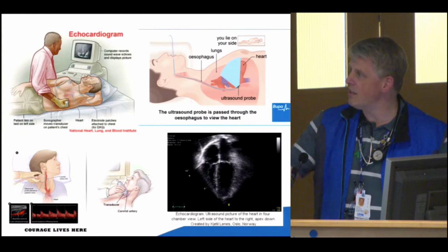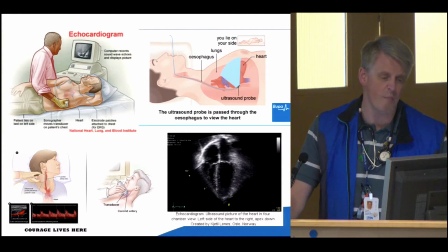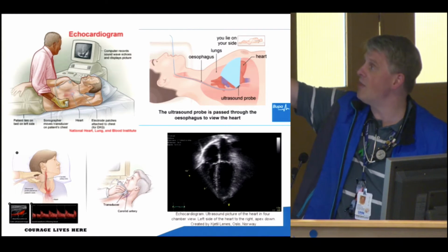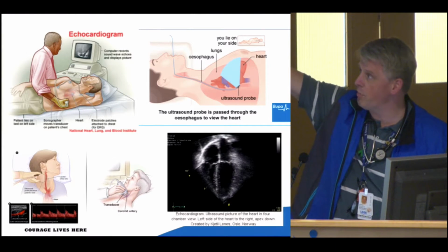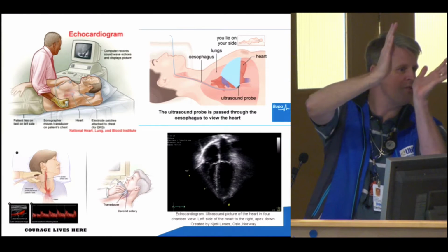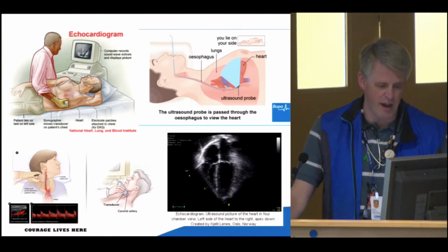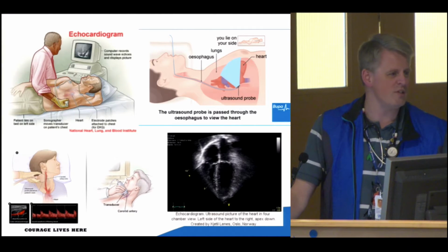All right? This is what the different procedures look like. So top left is just the standard echocardiogram looking through the chest wall. Not a complicated procedure, doesn't take a lot of time or prep work. The one beside that in your upper right, that's the transesophageal one where they actually put the probe down your throat. And then you can see that little blue image of light taking a look at the heart that represents the sound waves. Third one is just a Doppler of the carotid arteries in the neck.